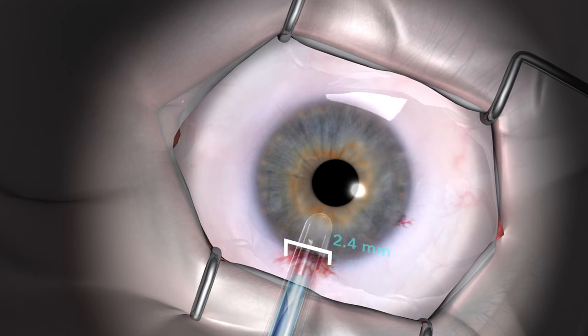Insert the tip of the cannula through a 2.4 mm incision. Based on experience and preference, surgeons may choose to use a smaller incision size.